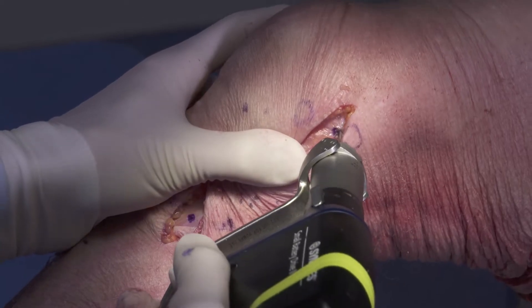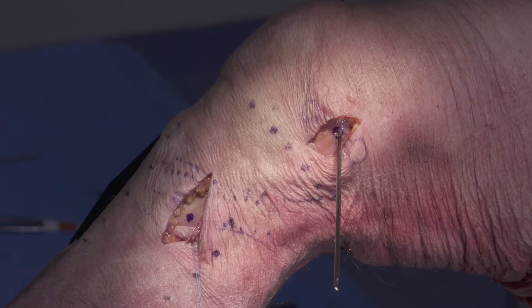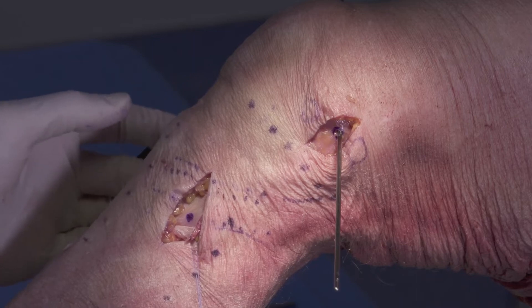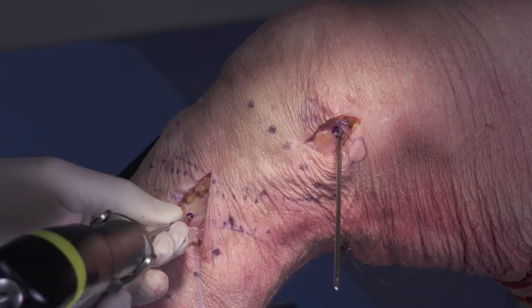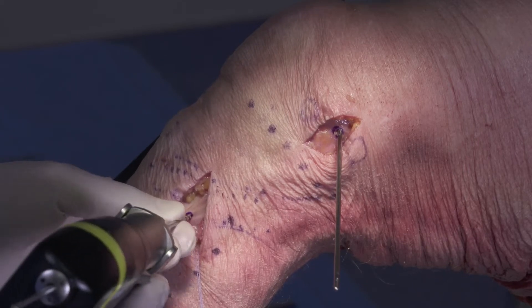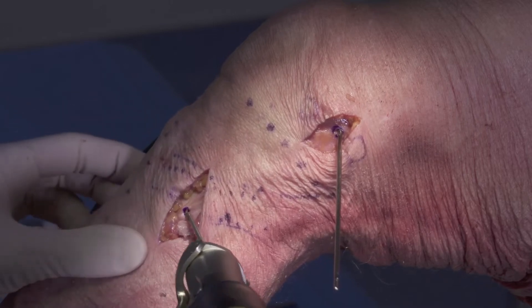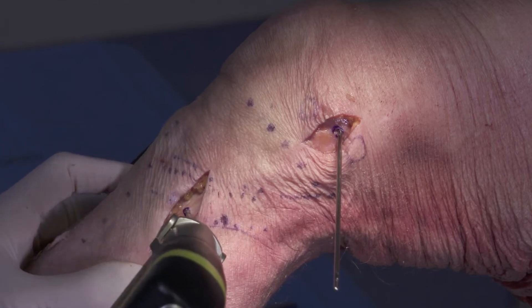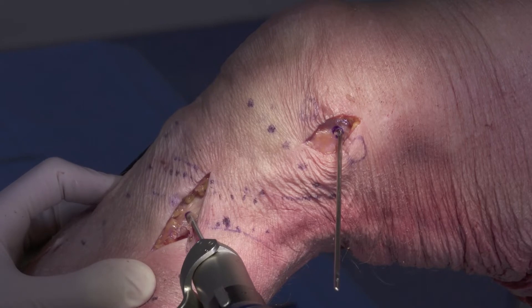We're going to drill this all the way out the other side of the femur through the skin. Before drilling the tunnel, I like to also get my pin into the tibial side. I need to make note that my leg is slightly externally rotated and that the fibula is posterior lateral. While on this posterior medial border of the tibia, right in the center of the MCL insertion, I want to drop my hand so that I'm going perpendicular to the tibia in the anterior to posterior plane. We're going to go bicortical all the way out the skin with this as well.